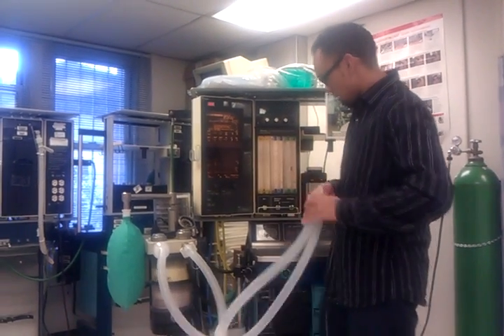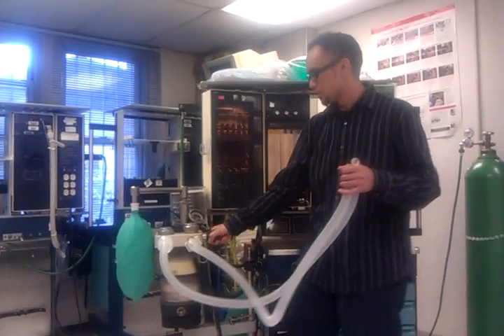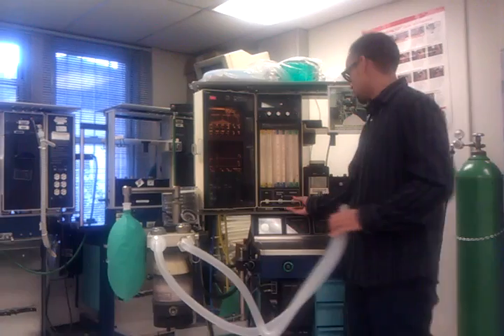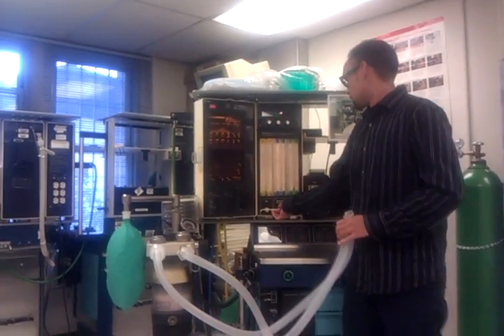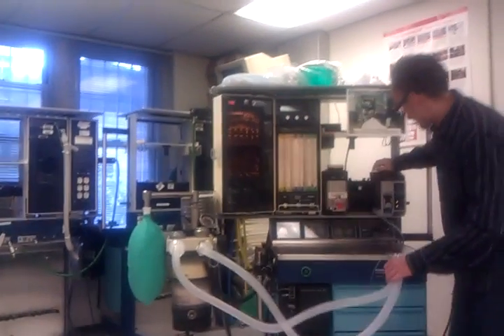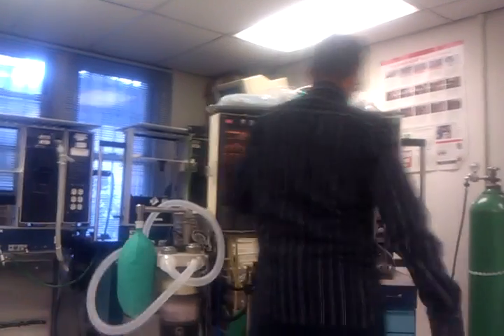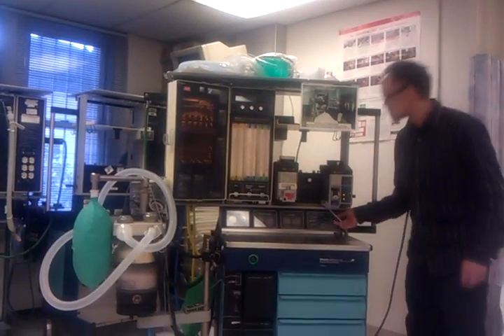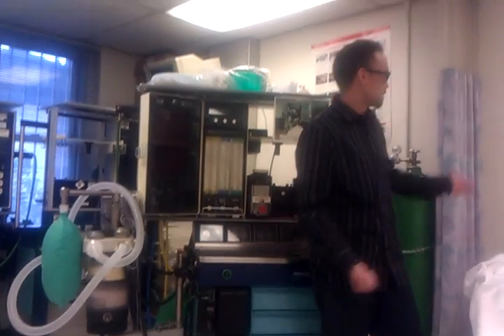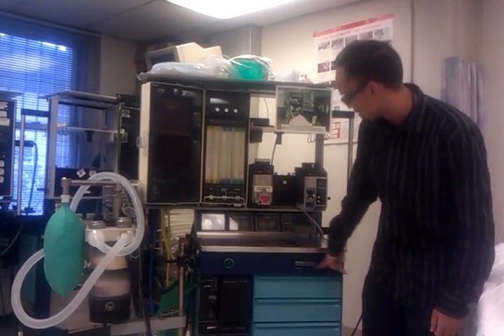Now for my final check: make sure the switch is on bag, APL valve is all the way open. I want to make sure my flow meters are all the way off so I don't desiccate the CO2 absorber. Make sure my vaporizers are off. Finally, if you don't want to waste electricity, just turn off the machine. If I had a Yankauer suction, I would check that too if it's connected to a wall. That's the Omeda checkout.